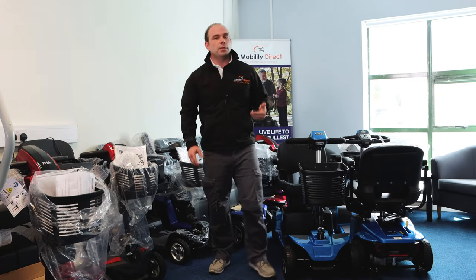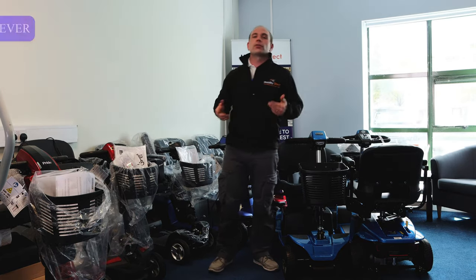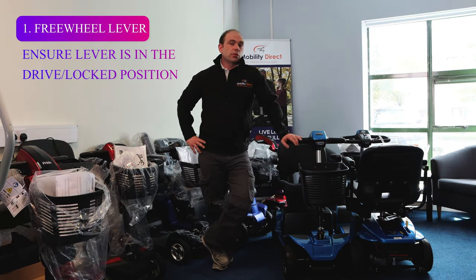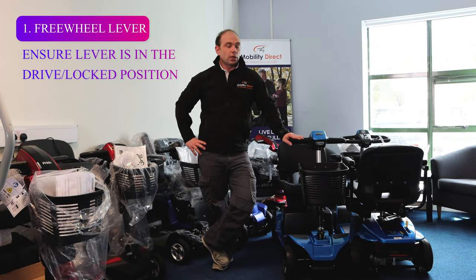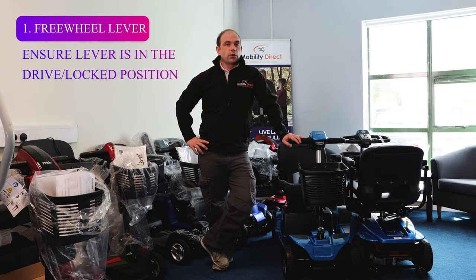Number one: if your scooter is making a beeping noise when you turn it on, check that the freewheel lever at the back of the scooter is in the drive or locked position. This is going to depend on manufacturer, but in the case of a Pride scooter, you usually have a yellow lever at the rear and you pull the lever back or away from the scooter to put it into the drive or locked position.